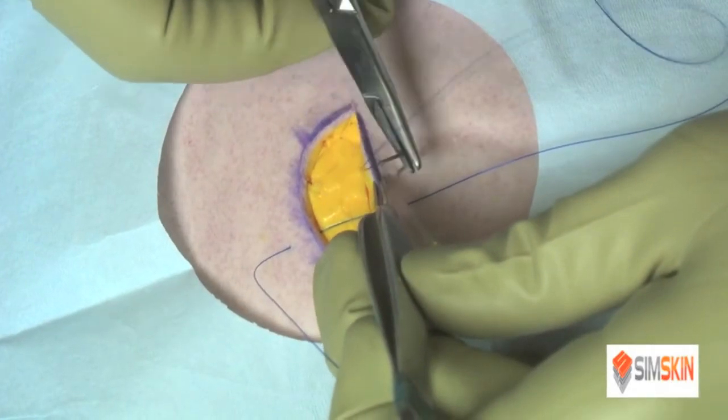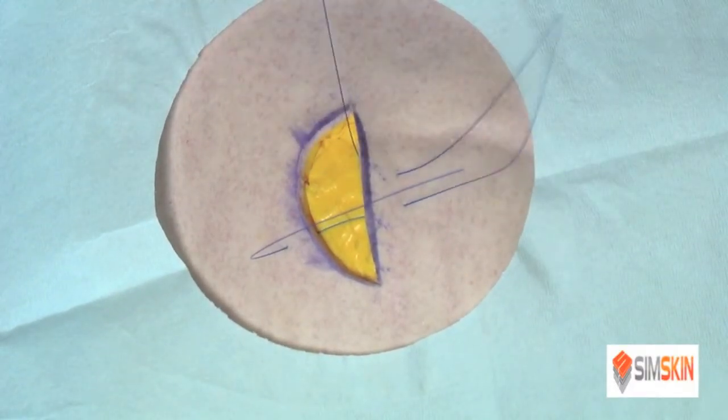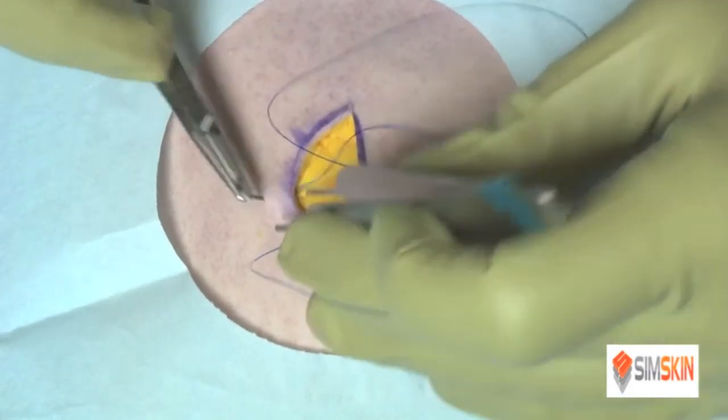It's set up very similarly to a horizontal mattress suture, just as you see here. Superficial to deep, go horizontally, and then go superficial to deep once again. But the critical step is coming up right here.